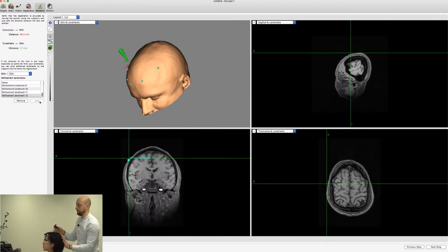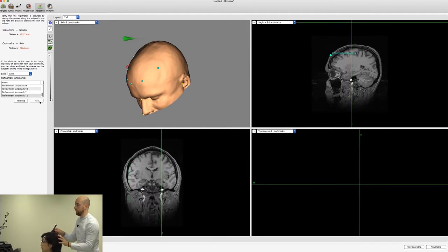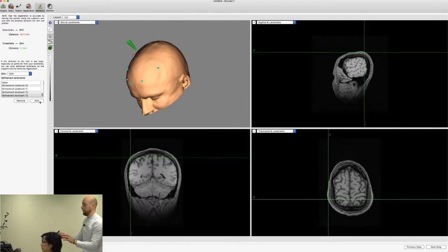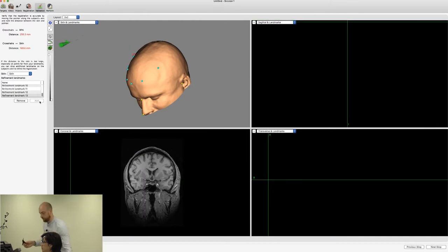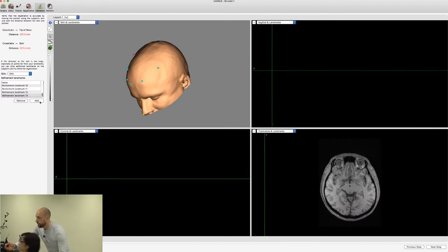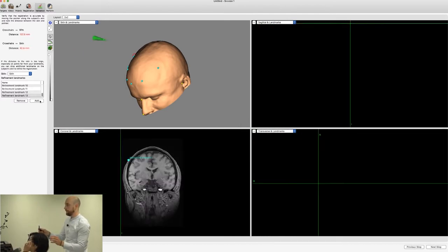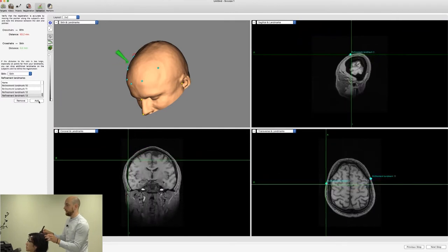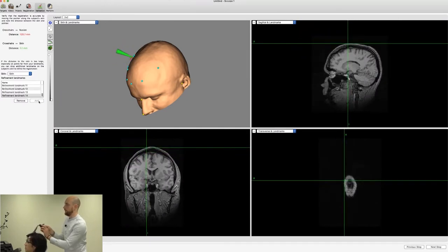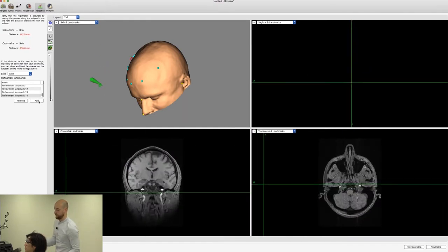So it's just losing us on the back of the head. If you put your head forward for me a little bit. And then, can you shuffle forward for me a little bit? Go towards the camera, a little bit more, further towards the camera. That's it. There we are, that's good. Keep clicking. And then we go across. Oh, come on now, okay.